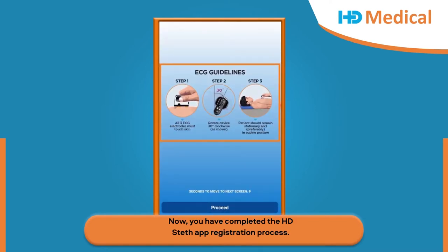Now you have completed the HD Steth app registration process. You are all set to use the app. Here is the overview of the app workflow along with your HD Steth device. Here are the HD Steth ECG guidelines that the user has to follow.